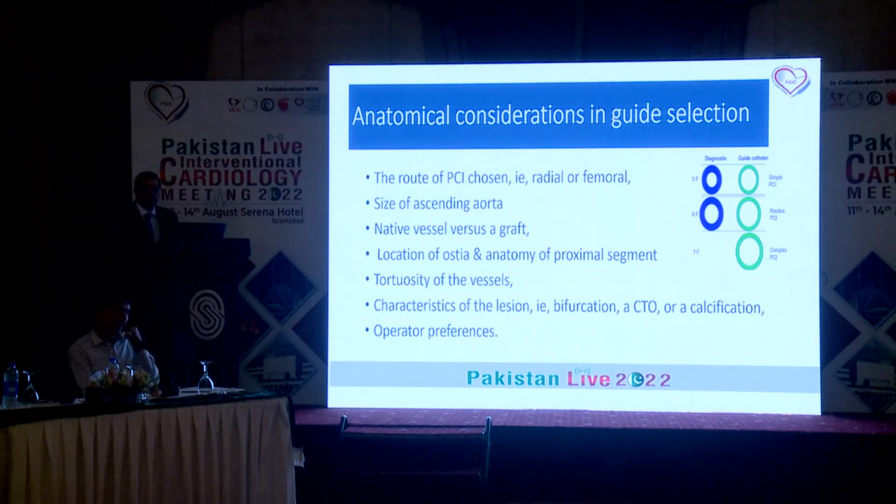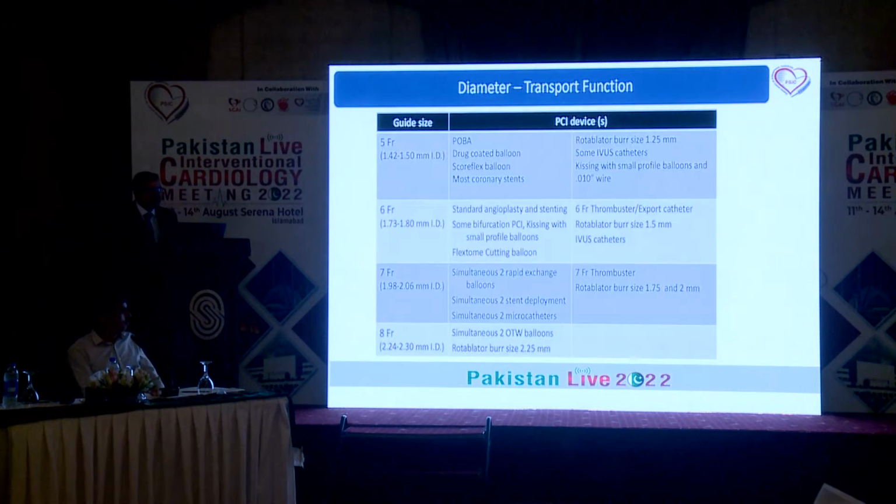Then the characteristics of the lesions matter, because if you are dealing with a bifurcation, you would need more hardware and you would need a bigger guide like 7 French or something. And finally, it is operator dependent. So this is a very important slide.